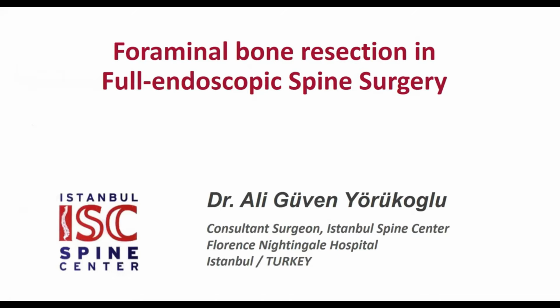I'm going to talk about the foraminal bone resection. I don't want to call it the foraminal or foraminatomy because these kinds of things sometimes confuse the surgeons. It's the bone resection with the foraminal access.